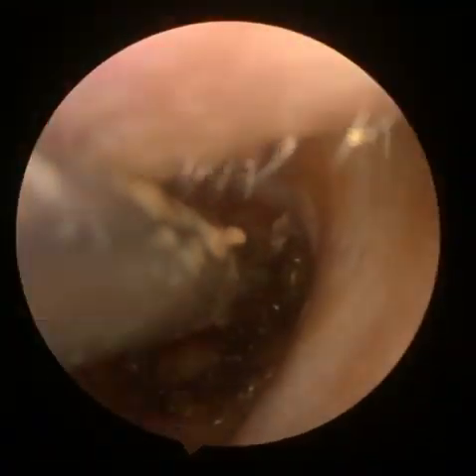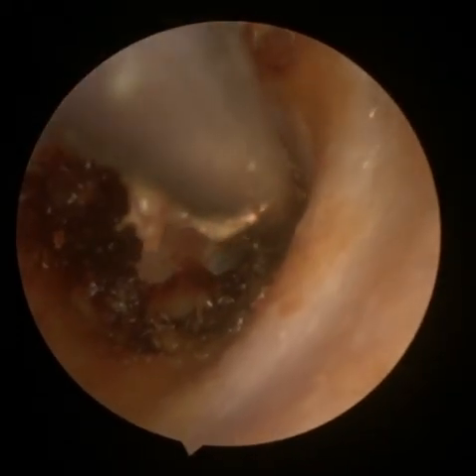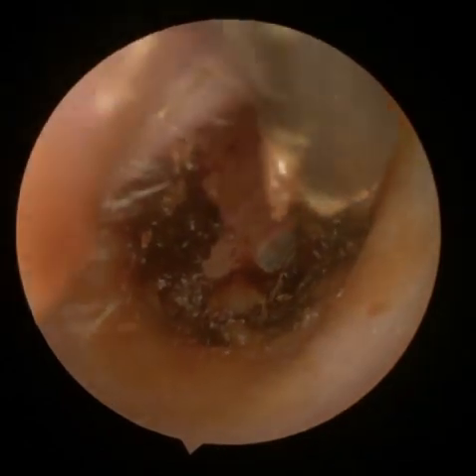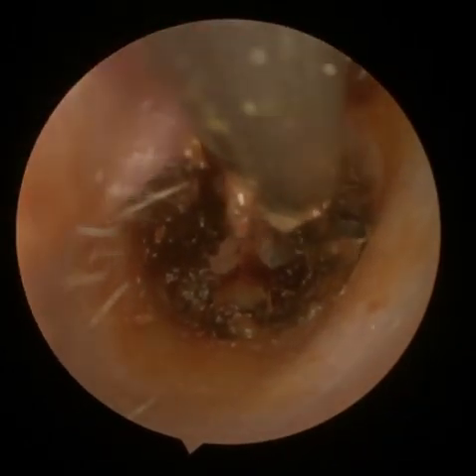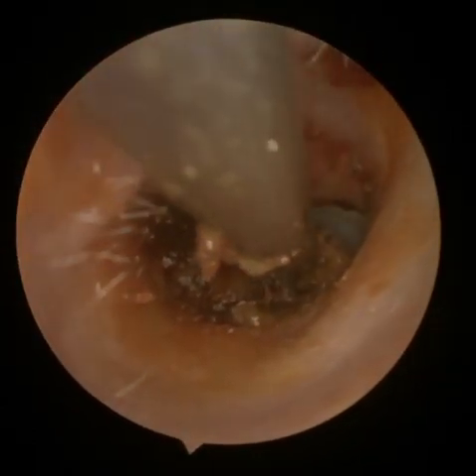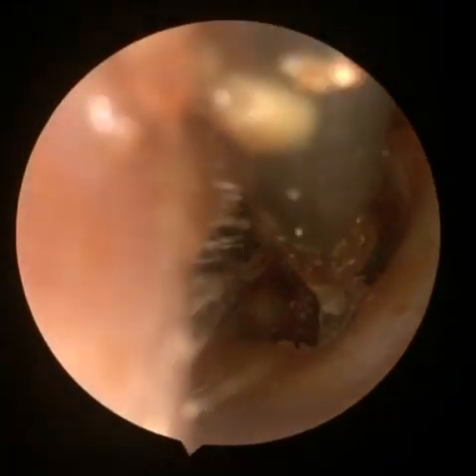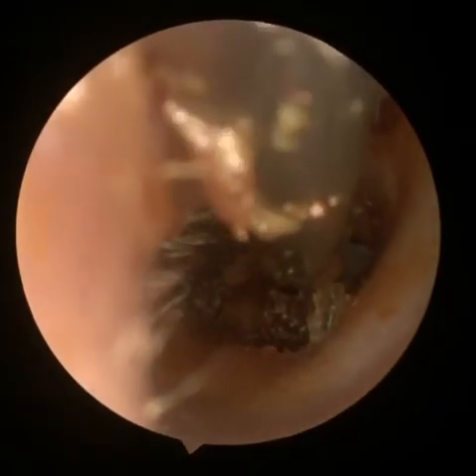You've got to be very, very gentle — there's not much space in there. There we go, just taking it away; you can see all that sticky wax coming away now from that drum. It's a little bit bumpy in there as well, which means sometimes it's a little bit difficult to get the view that you want, especially around a corner or a crevice, so you have to be particularly careful.